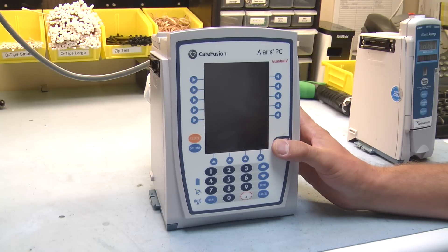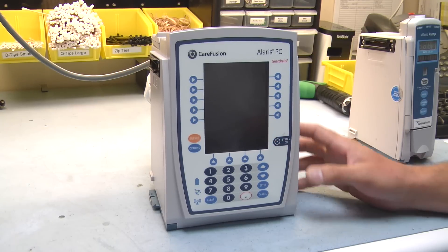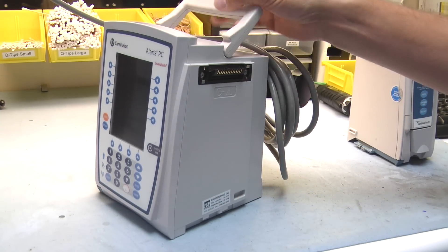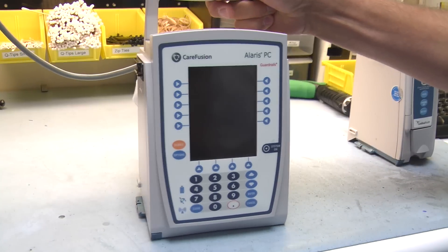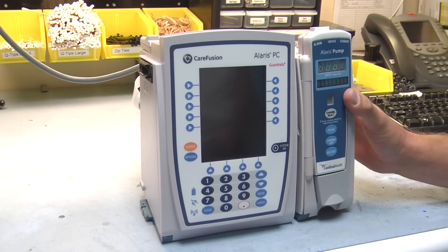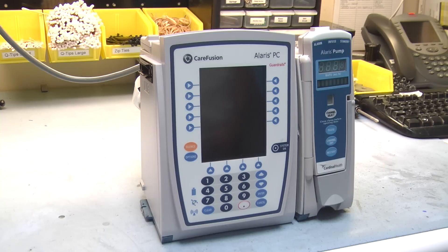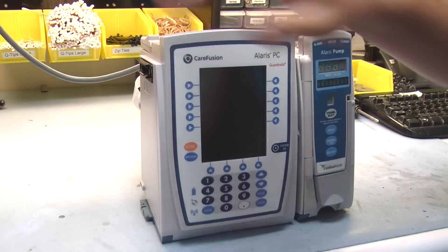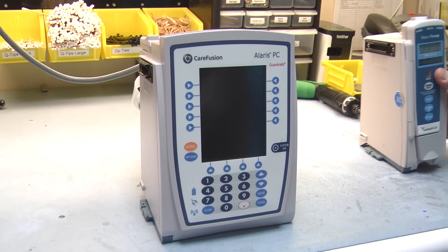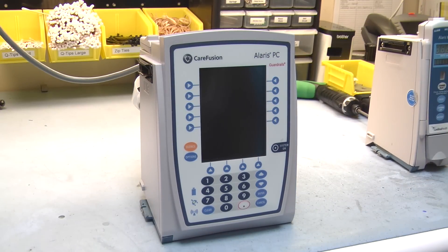The first feature we'll see here is you have your IUI connectors on the right and the left side. This will allow you to connect the Alaris 8100 pump to it. You can actually connect two to each side, giving you four pumps. You can also connect your syringe pumps, PCA modules, and SPO2 modules to it.